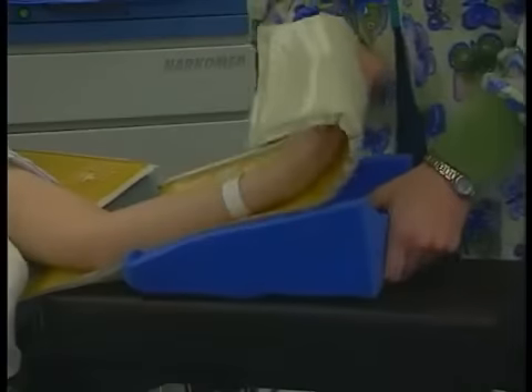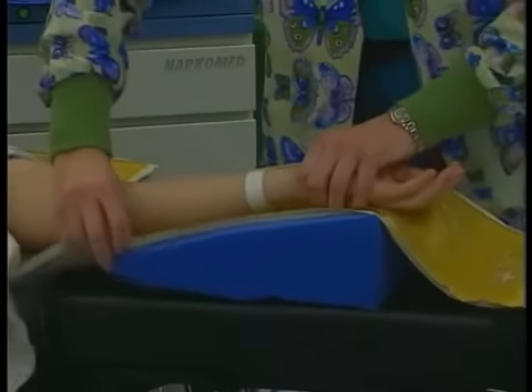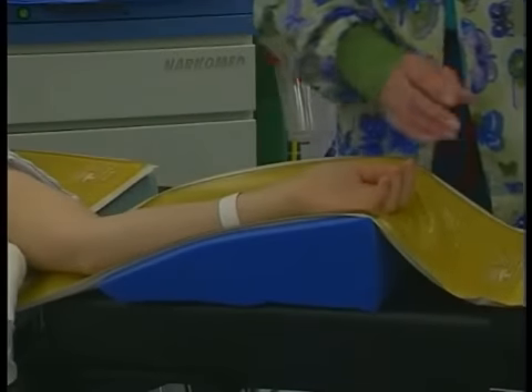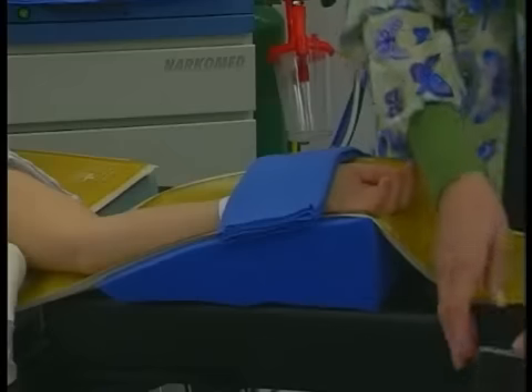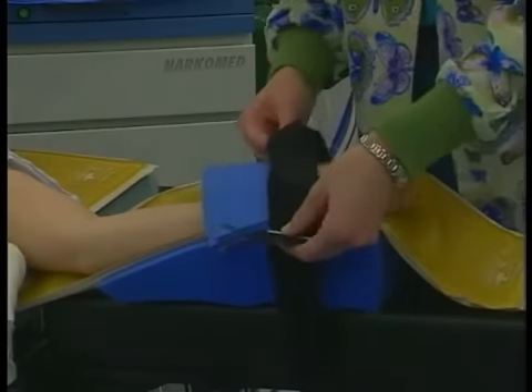For patients whose arms must be out on arm boards for long periods of time, slight flexion of the elbow from a wedge under the forearm can help to reduce the stretching of the nerves in the upper extremity. Always check to be sure that the arm boards are well padded.